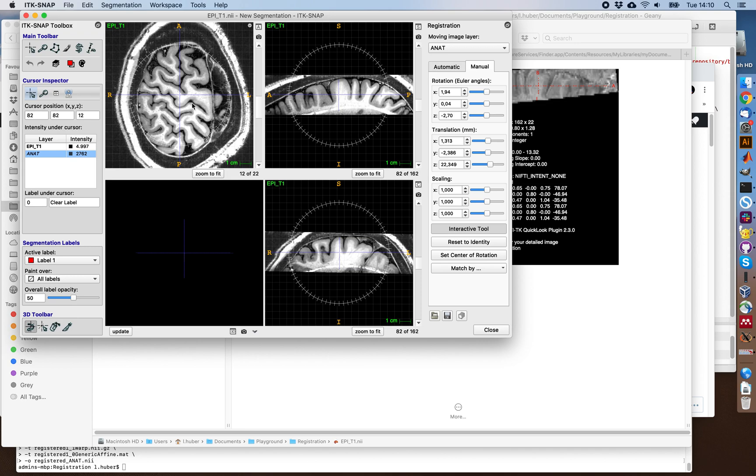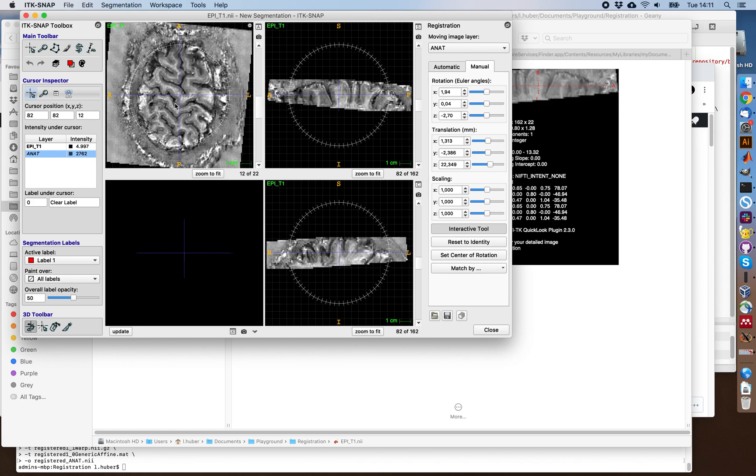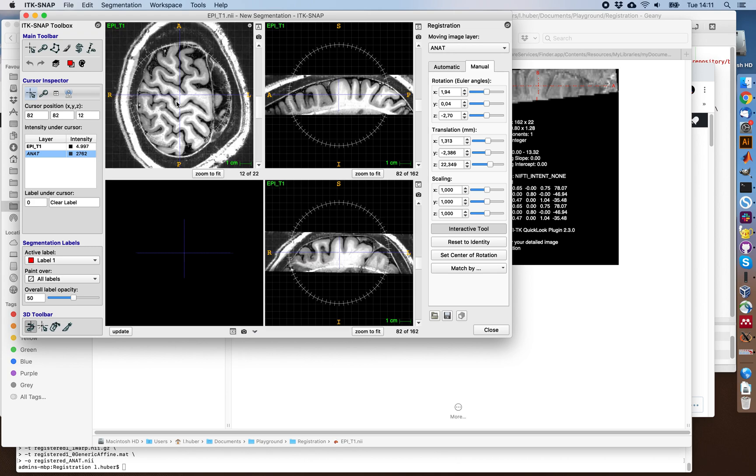So here I'm specifically interested in this middle sulcus here. This would be the central sulcus. And this is an fMRI study investigating the motor cortex, which would be right over here. The sensory cortex would be here. And in this area we now have a rough first initial guess by aligning the anatomical scan to the EPI.